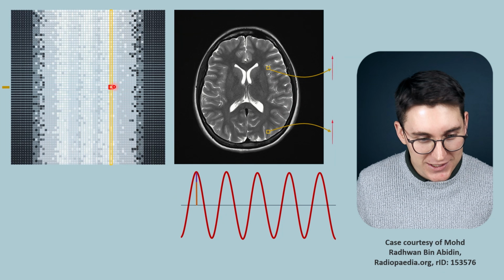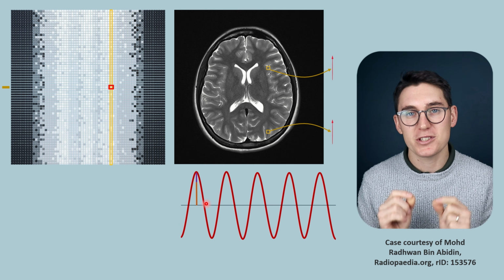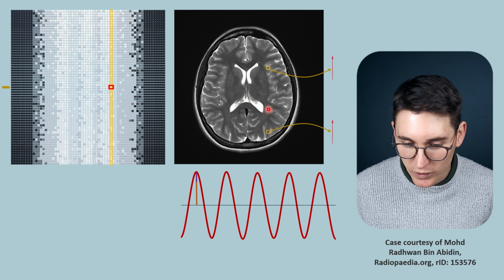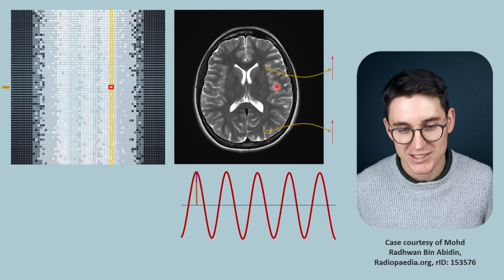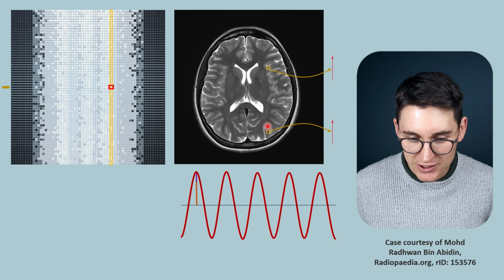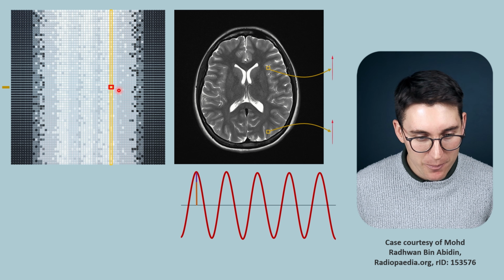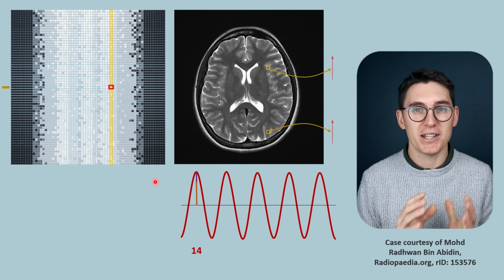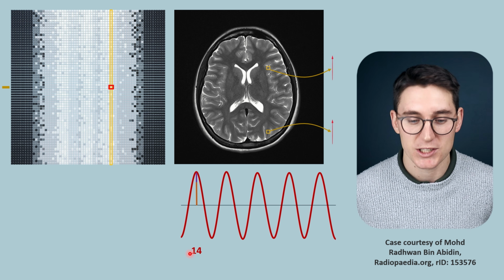We've taken that point in time where we've used our k-space and this frequency encoding data to get a measurable signal that we can calculate that's coming from this entire x-axis column here. Now again, we're making the assumption that this signal is only coming from these two pixels. In fact, they're coming from 256 different pixels along the y-axis here. Now we don't know the individual signal contributions from these two separate pixels, but we do know what the signal is based on the calculation that we've made from the entire x-axis column here. And that signal can be given a specific numerical value. For this example, it's arbitrary, we're going to use 14.